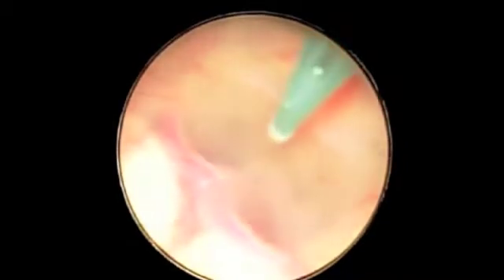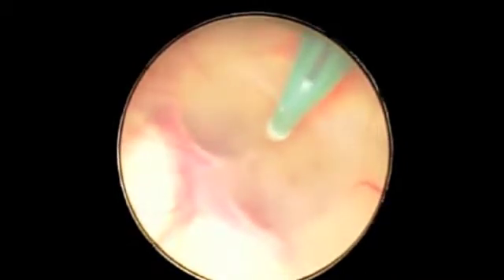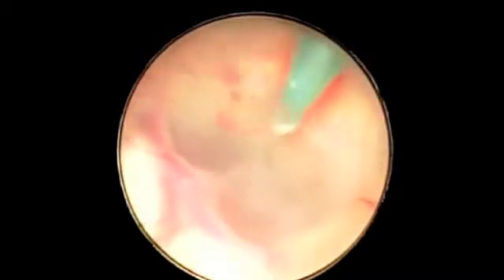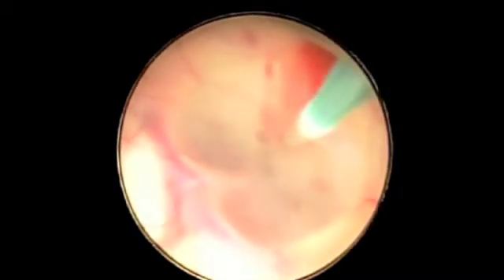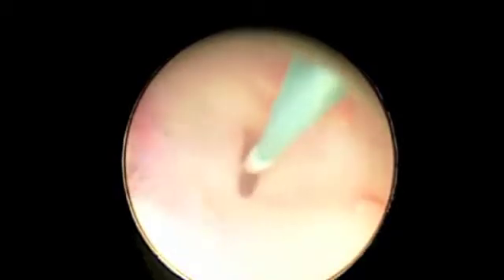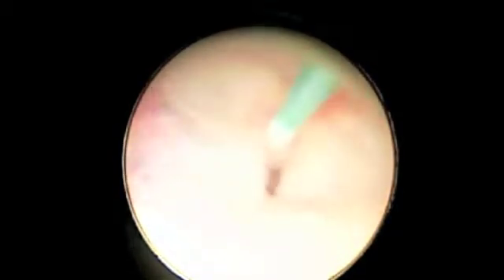A point at the thinned out floor of the third ventricle at the tuber cinereum, anterior to the mammillary bodies, is selected and perforated using a Fogarty balloon. The balloon is then dilated to widen the stoma created between the third ventricle and cisternal spaces.